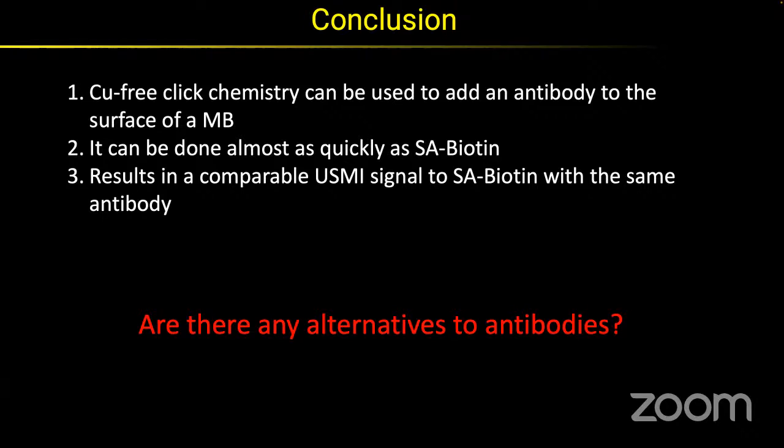I think that step has really held back a lot of people from working with ultrasound microbubbles and clinically translating them, because in those first steps, it's really hard to hone in on whether a particular target will work with these bubbles.